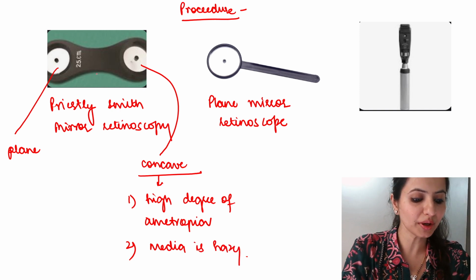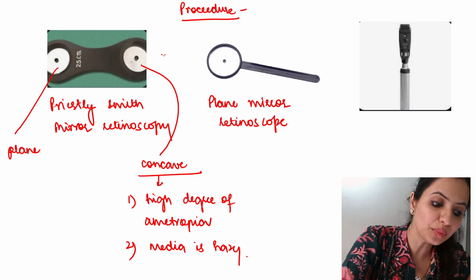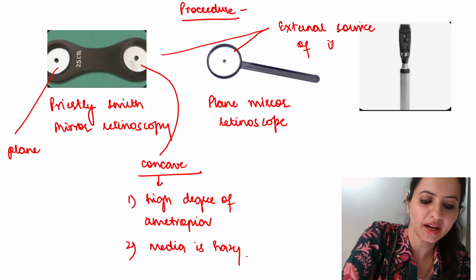So if we look at these two types of mirror retinoscopes, they both need an external source of illumination, right?